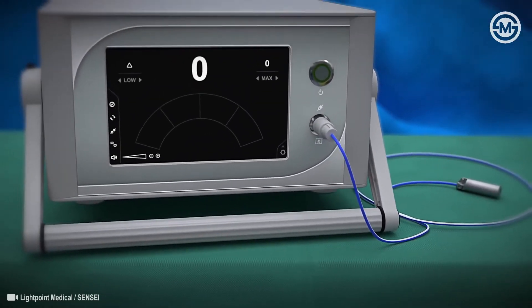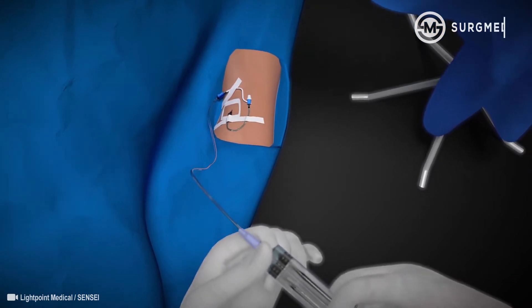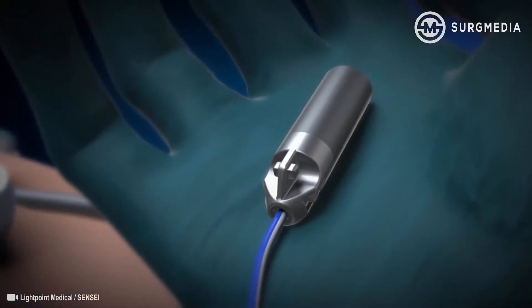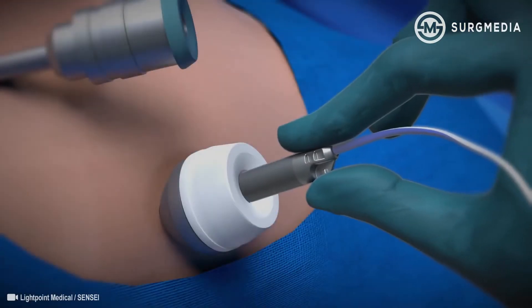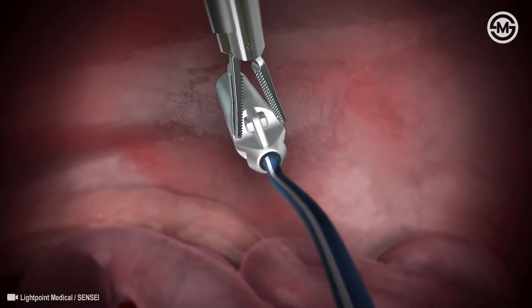The aim of cancer surgery is to find and remove cancer while sparing healthy tissue. Sensei is a probe designed to help surgeons find cancer more accurately. Before surgery, patients are injected with a cancer-targeted drug that binds to cancerous tissue.